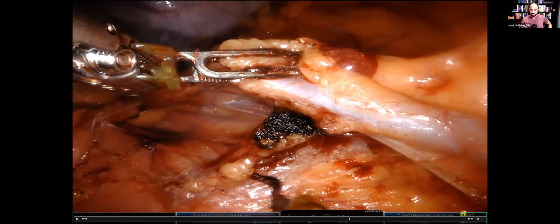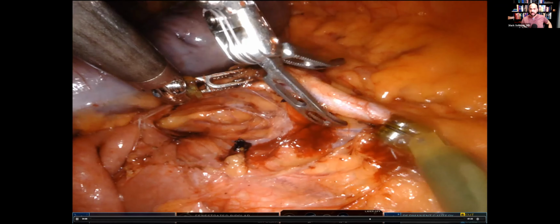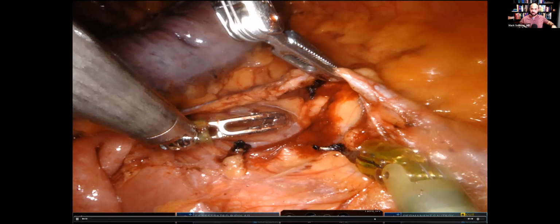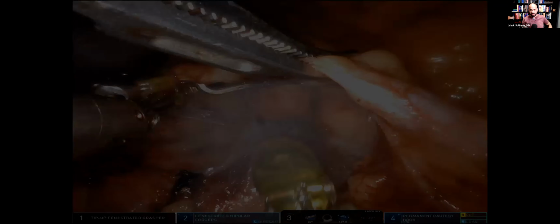What I do is I actually position the patients first before the operation even begins, test them in that 30 degrees Trendelenburg with no drapes on, so everyone can see that they're doing okay and they're safe, and then we actually dock the robot and get the case started.